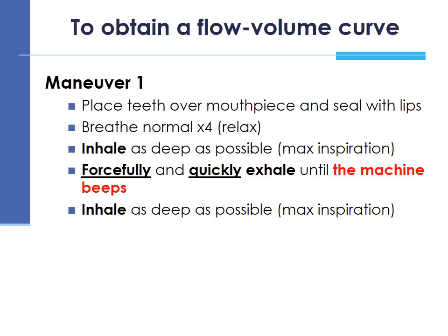The maneuver to obtain the flow volume curve is quite different from getting a spirogram, because if you remember from the maneuver that was performed in order to get the spirogram, slow and complete breaths were taken, so there was no forcing taking place. But with a flow volume curve, this is a forced maneuver. In other words, the air has to be pushed or forced out during exhalation if you want to get proper results. Now this slide explains the first of the two maneuvers.